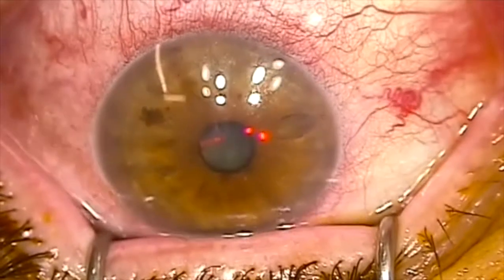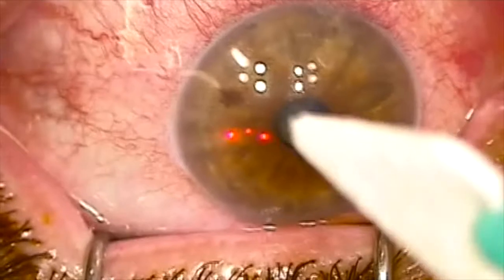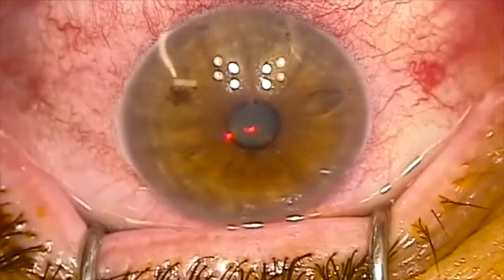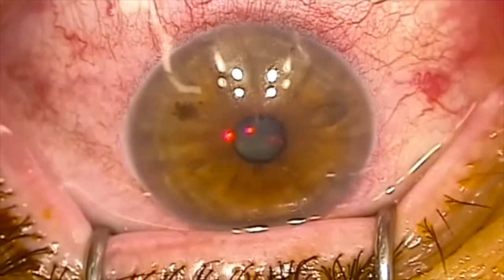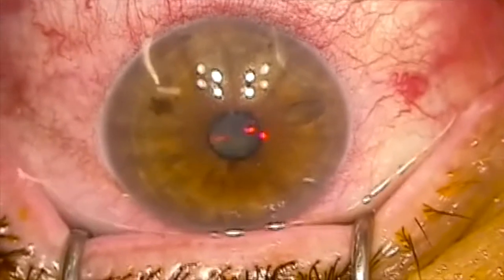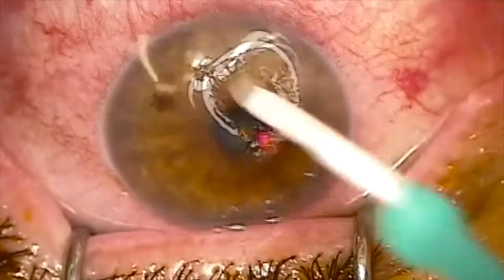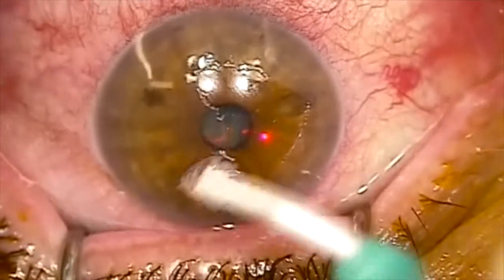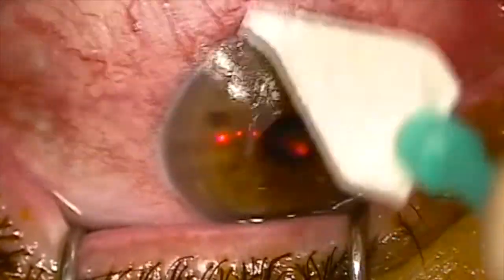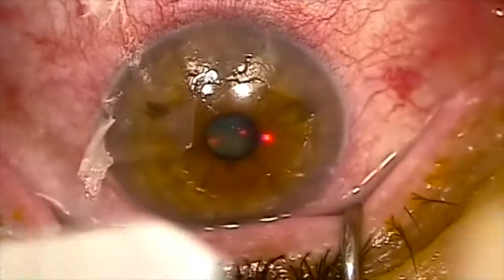The surface layer of cells of the eye is sometimes removed with the laser as part of the procedure, and other times it's removed manually. You can see me removing the surface cells here. After the laser part, we'll perform the collagen cross-linking procedure — that's where we soak the eye in vitamin B, or riboflavin, which is vitamin B2, and then apply an ultraviolet light to the eye. The ultraviolet light and the vitamin B interact in the cornea to make it much, much stronger.